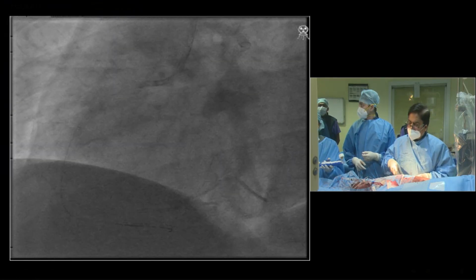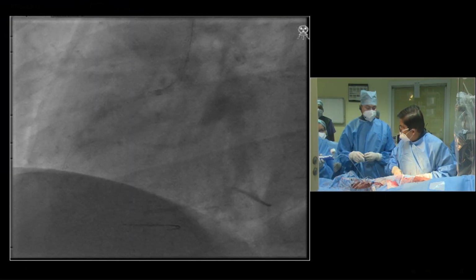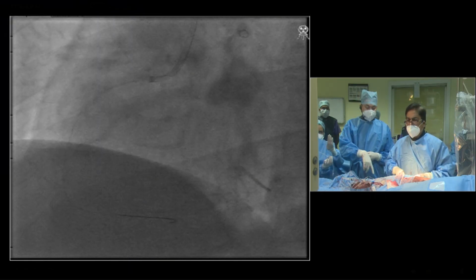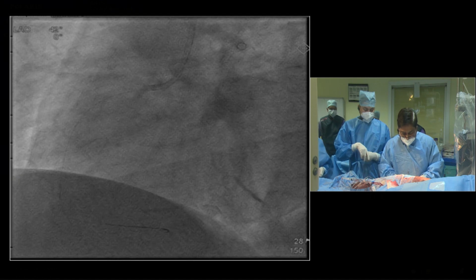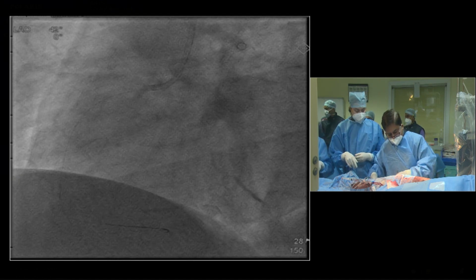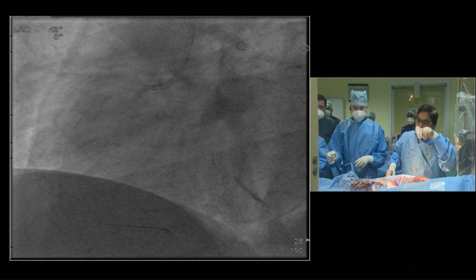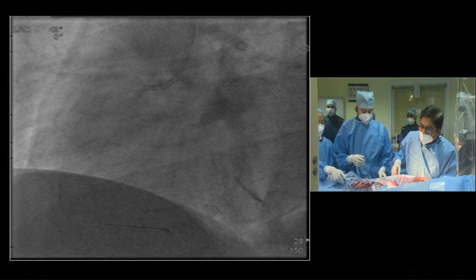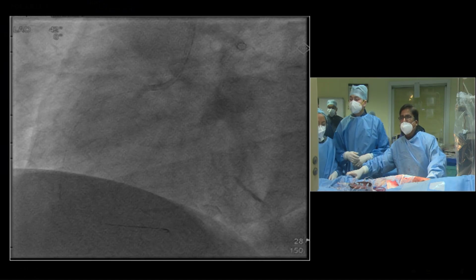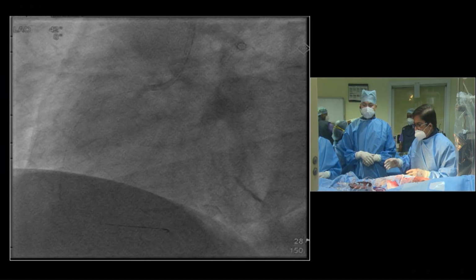If the distal vessel, especially the PLV, has some disease, it will be okay. You don't have a crusade? I'm surprised. Flooring is happening, sir. No problem. Not every cath lab in the country has one. I remember when I did an IGCT on one live case from Apollo Hyderabad, when I was asking for a crusade, they gave me a corset.